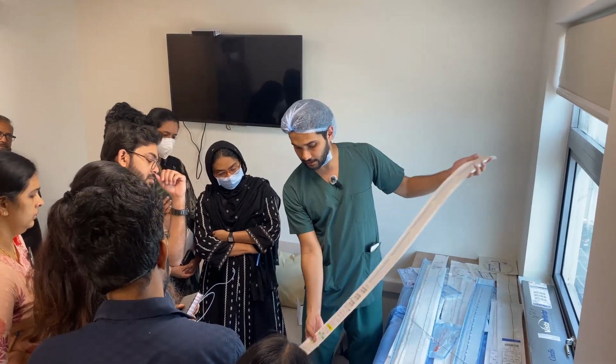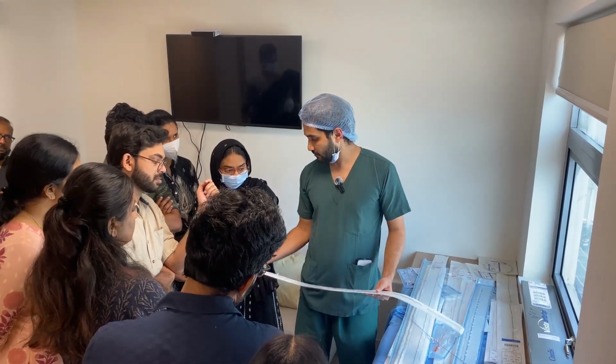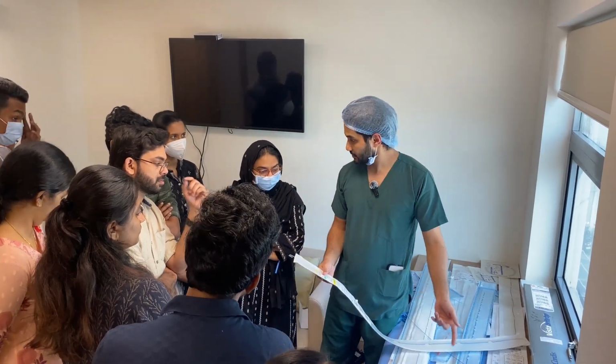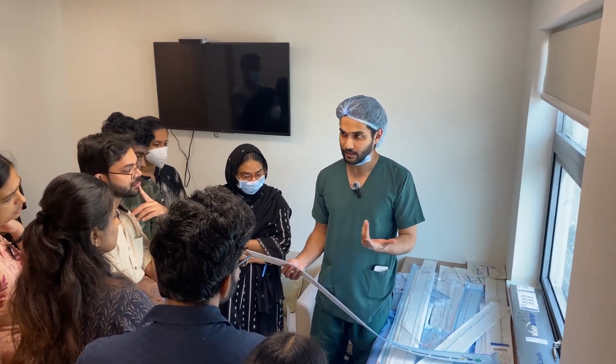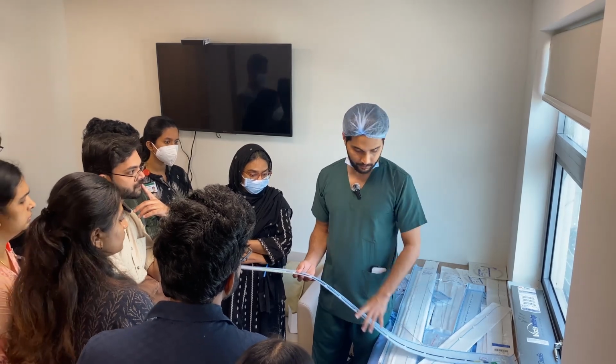ഇത് എൻവോയ് എന്ന് പറയുന്ന ഗൈഡിങ് കത്തീറ്റർ ആണ്. ഇതിന്റെ ലൂമൻ കുറച്ച് വലുതായിരിക്കും, 6 ഫ്രഞ്ച്, 5 ഫ്രഞ്ച് ആയിരിക്കും ഇതിന്റെ സൈസ്. അതിന്റെ അകത്തൂടെ ഈ ചെറിയ കത്തീറ്റേഴ്സ് പാസ് ചെയ്യാൻ വേണ്ടി. ഇത് ന്യൂറോമാക്സ് എന്ന് പറയും. നമ്മുടെ സെറിബ്രൽ ആവശ്യങ്ങൾക്ക്, അതായത് അന്യൂറിസം കോയിൽ ചെയ്യാനൊക്കെ അതിന്റെ അകത്തിടുന്ന ഒരു ഗൈഡിങ് കത്തീറ്റർ ആണ് ഇത്. ഇത് രണ്ടും മെയിൻ ആണ്.